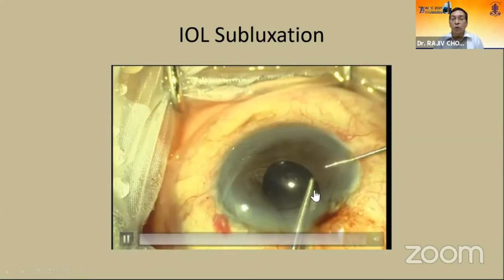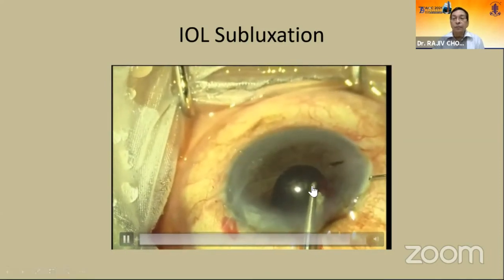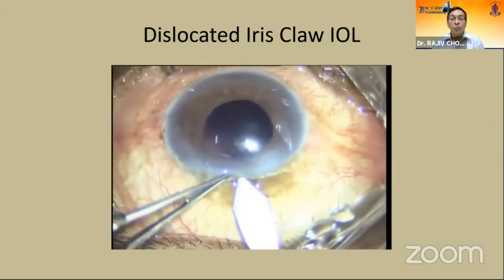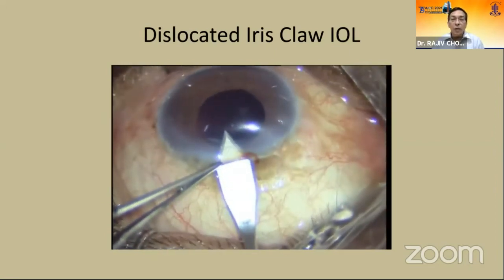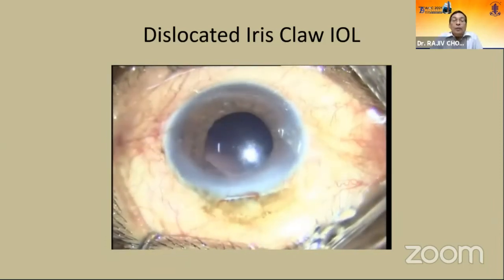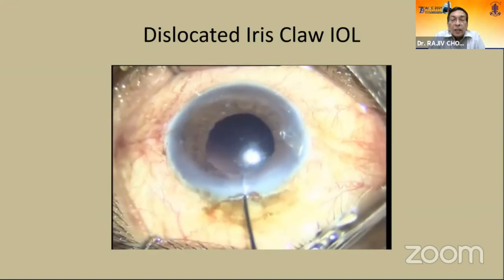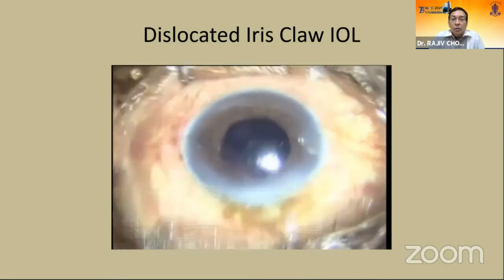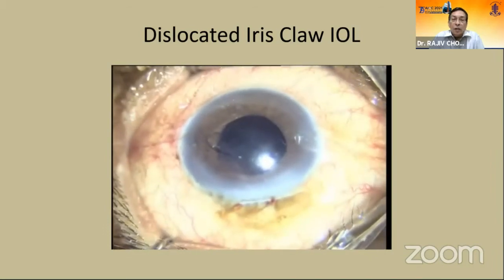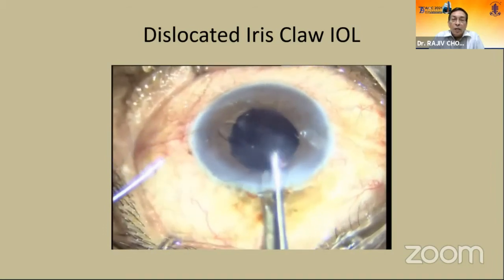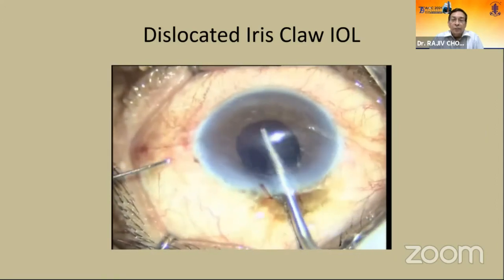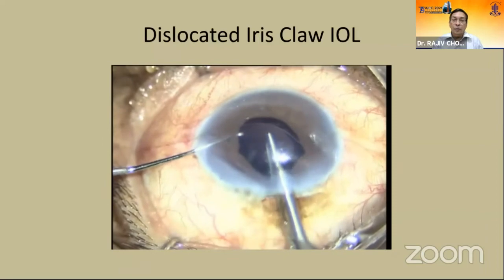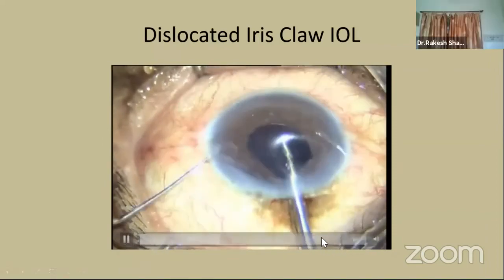Fear of lens dislocation due to iris atrophy is very rare. The advantage of iris claw is that whenever it dislocates, it is always one side that de-enclaves and you can easily re-enclave it. A case is shown where the lens dislocated from the left side — we simply brought the lens up into the anterior chamber and re-enclavated it in the same position. Irrigation to remove viscoelastic.